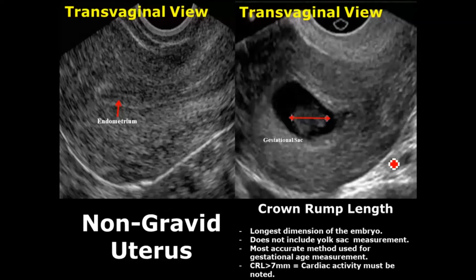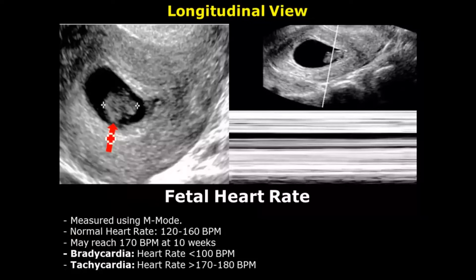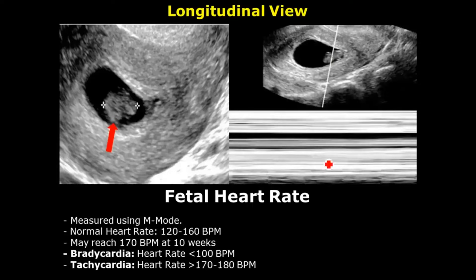If the CRL is more than 7 millimeters, cardiac activity should be noted. Fetal heart rate can be measured by using M mode. The normal heart rate range is from 120 to 160 beats per minute and it may reach 170 beats per minute by 10 weeks.